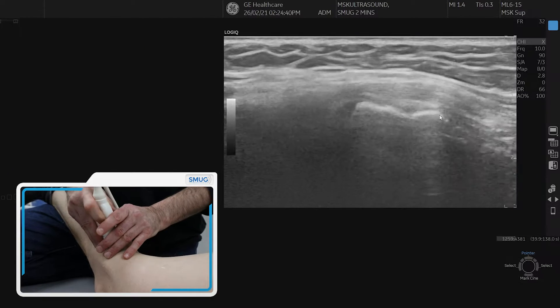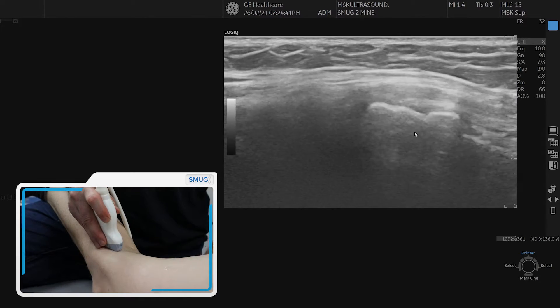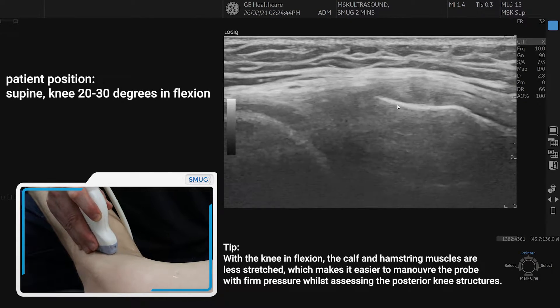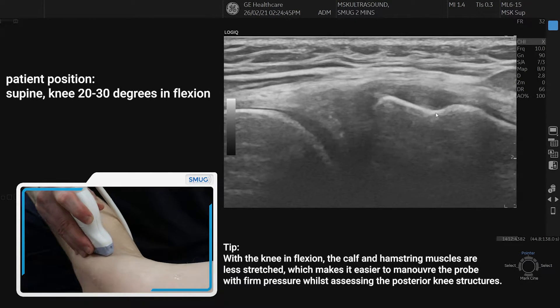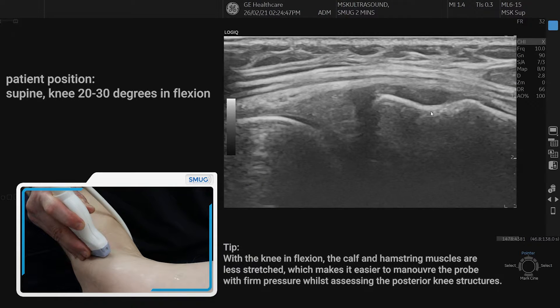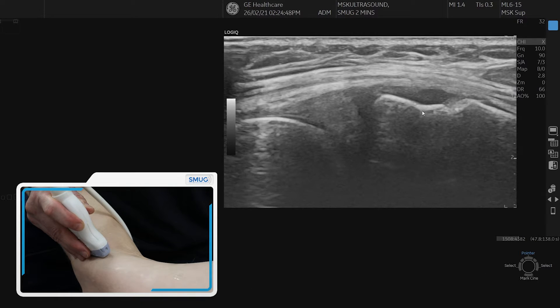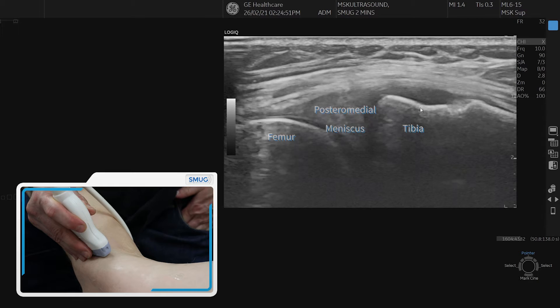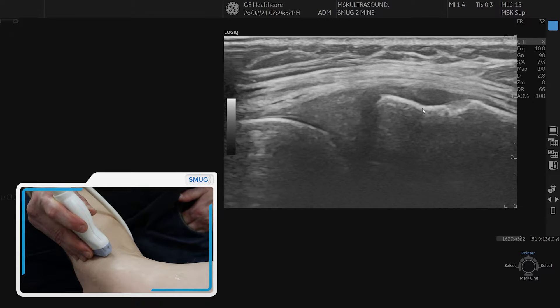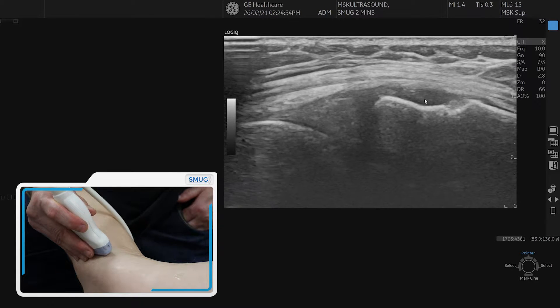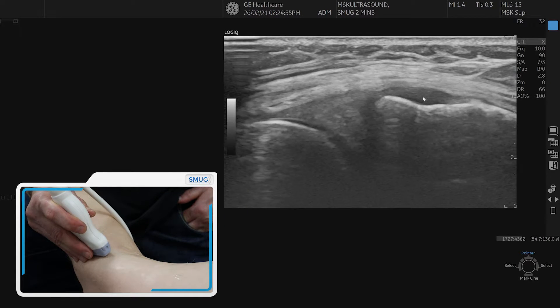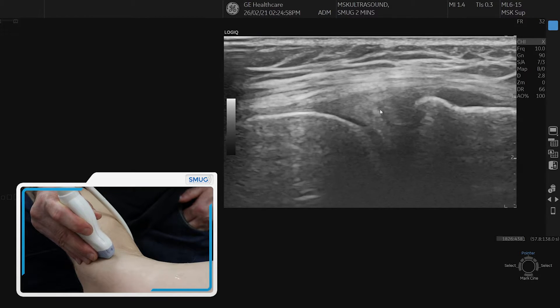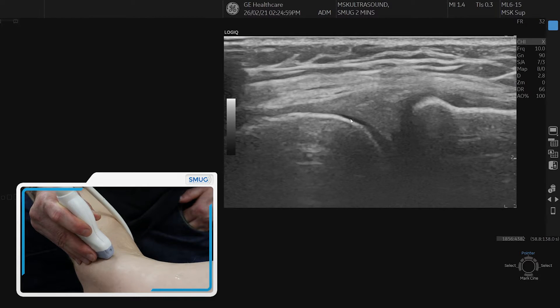We're going to show you how to assess the posteromedial knee joint. First, you identify the bony landmark — in this case the tibia on the right side of the picture, with a nice concave notch. That's the footprint where the thick tendon of the semimembranosus is attached. Then we see the joint line here with the femoral condyle on the left side and the articular cartilage on top. That's the starting point.